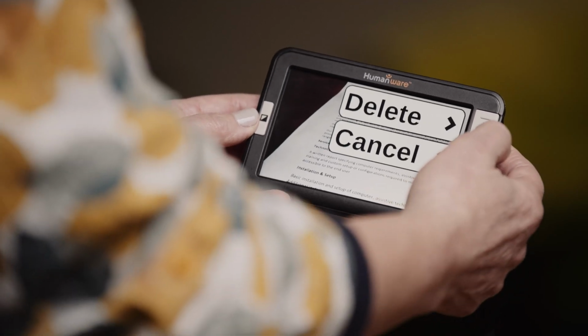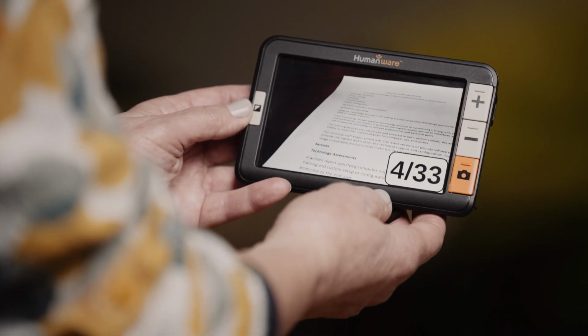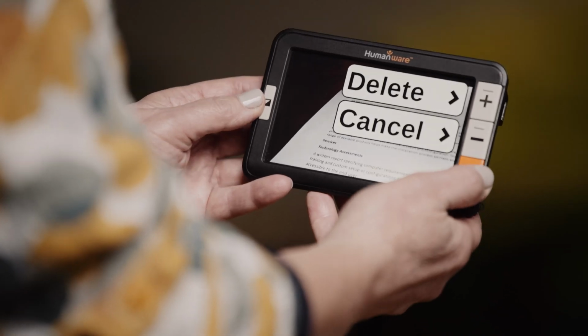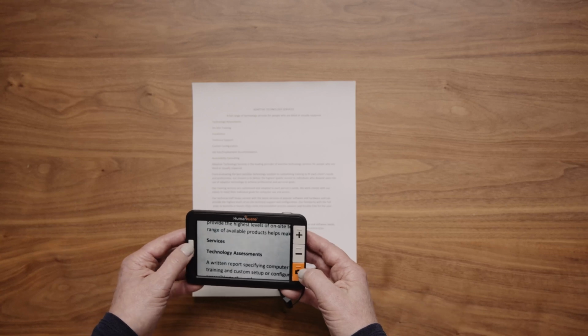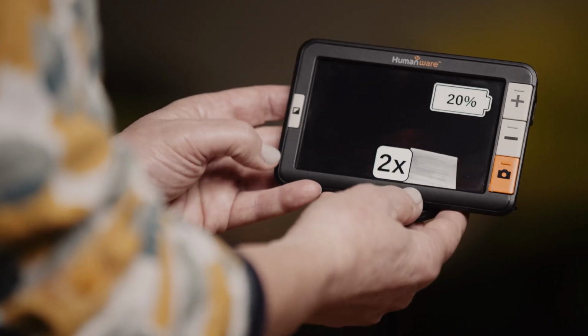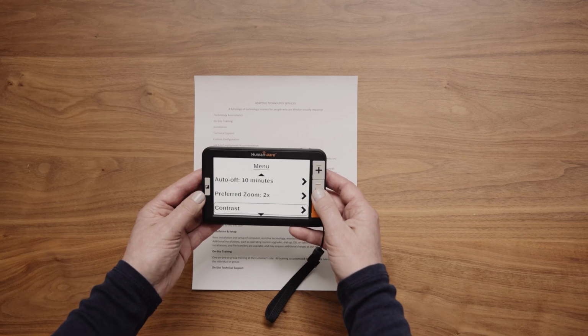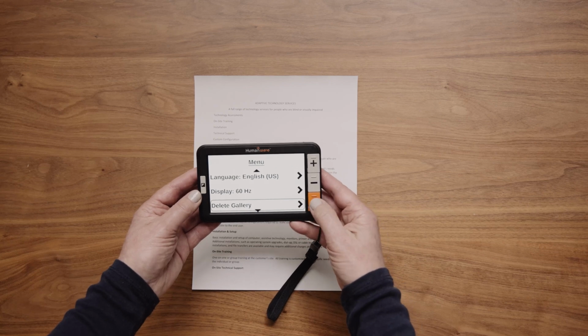4. Confirm deletion by pressing the Zoom In plus button. 5. Cancel deletion by pressing the Zoom Out minus button. 6. Press the contrast button to exit gallery mode. Note, you can delete all images at once using the Settings menu option, Delete Gallery.